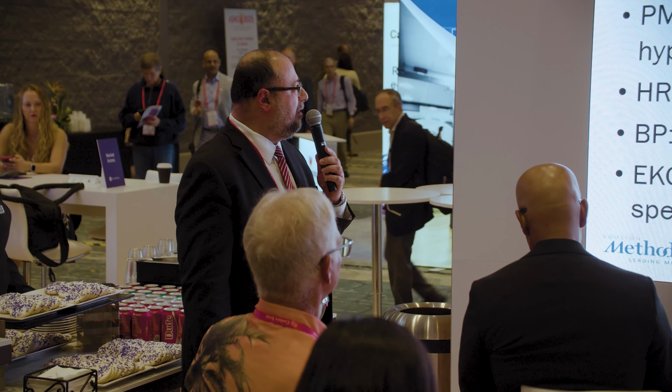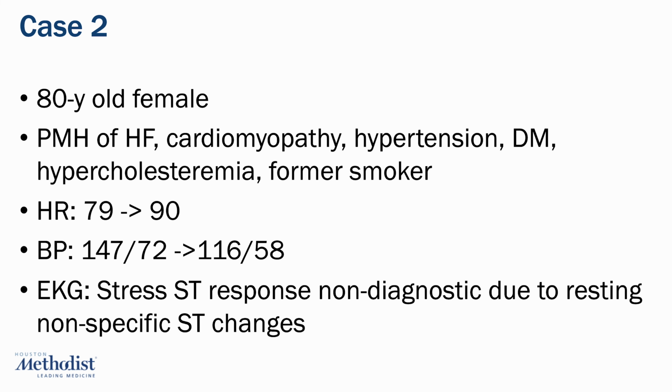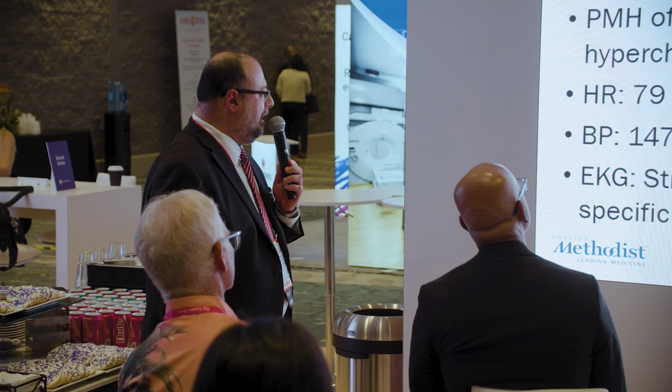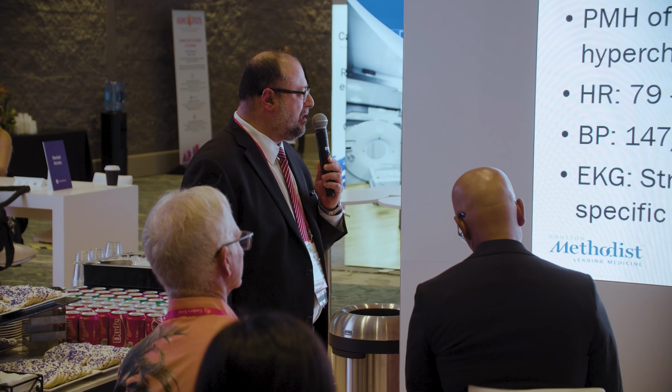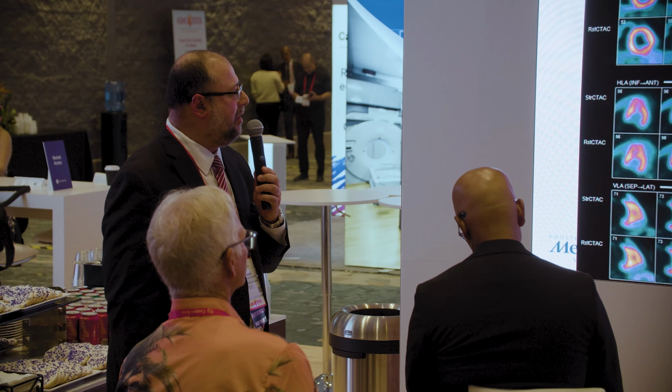All right, let's move on to the second patient. This is an 80-year-old female. She has a history of heart failure, cardiomyopathy, hypertension, diabetes, dyslipidemia, former smoker. When we gave regadenoson, her heart rate went up from 79 to 90. The blood pressure dropped, which is expected. And the EKG changes were non-diagnostic because there were some resting changes there.